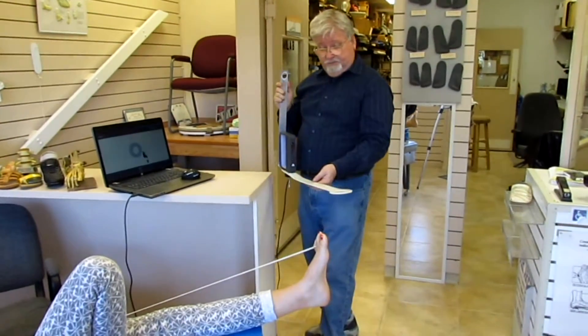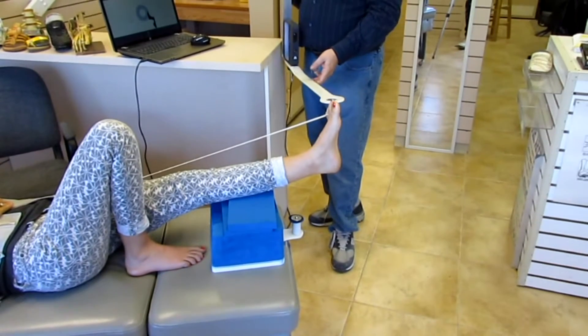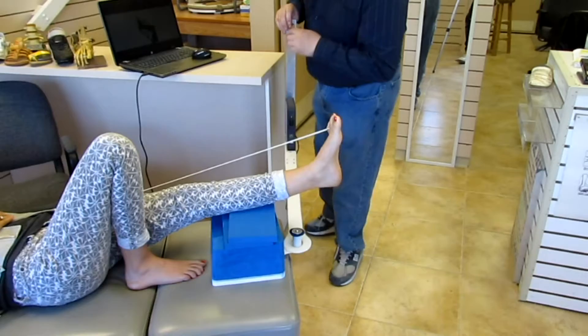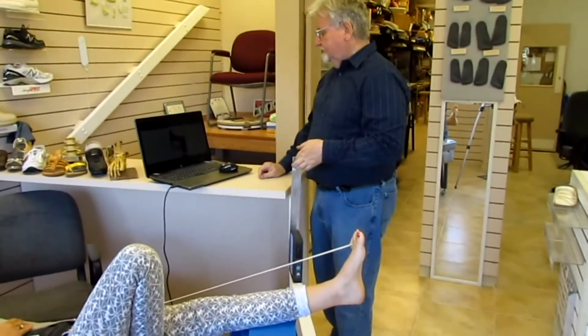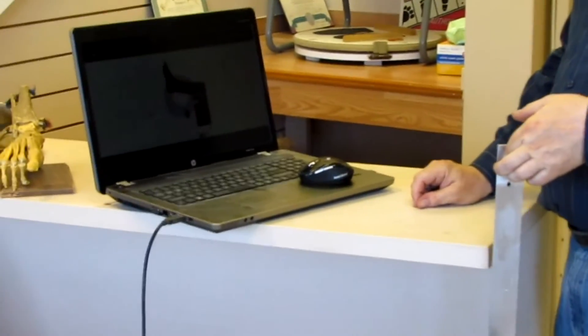Mr. Arch will now attach the pivot arm onto the pivot point on the bottom of the table. Snaps right in place very easily. And now we're going to go to a close-up of the computer program.